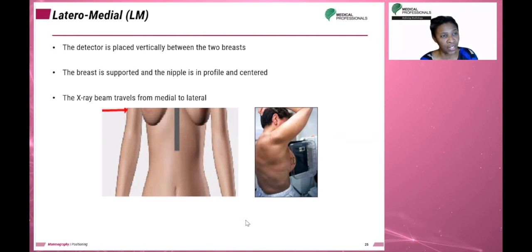If the patient has had surgery in the sternum area, it typically stretches the skin if you try to do a mediolateral, even the mediolateral oblique, and that can be extremely painful for the patient. So this projection is one of the options you can use for these non-conforming patients.